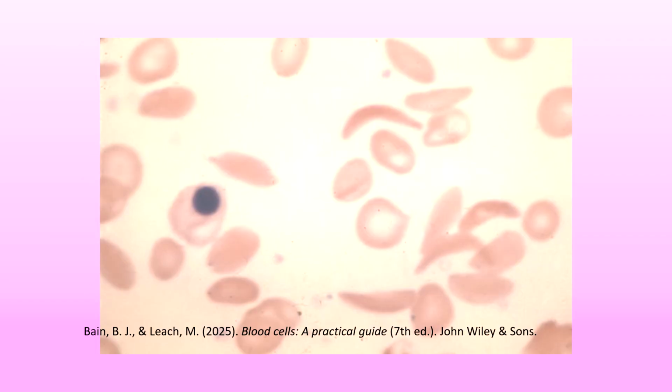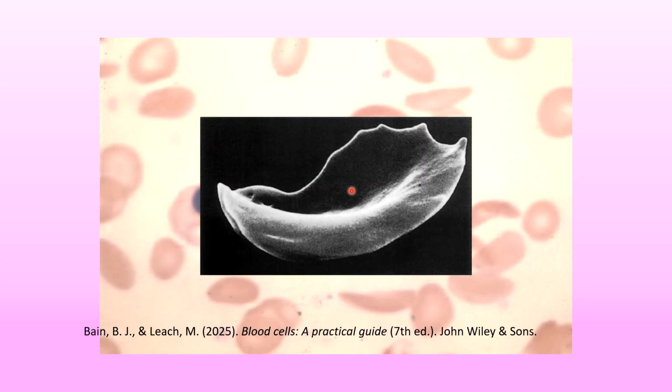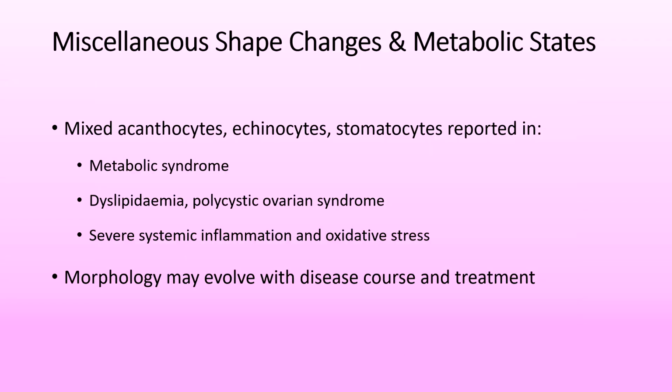Here you are able to see the peripheral blood image in which you see a nucleated RBC. There's so much anisopoikilocytosis, and this is a classic sickle cell in the peripheral blood. You're able to see the same thing in the electron micrograph of a scanning electron microscopy also. It shows the classical sickle type of shape.